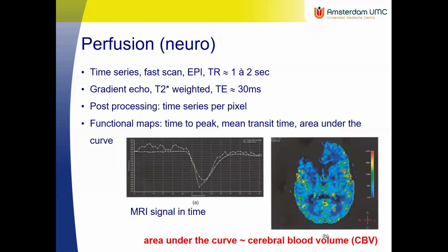All right. So I think I owe you another clinical example that will highly likely be presented on Friday in the clinical cases, and that is the neuro perfusion, and it's using dynamic scanning of the injection of a contrast agent.